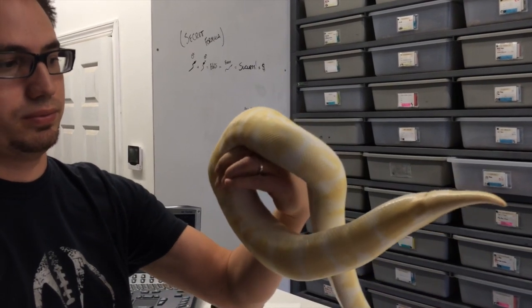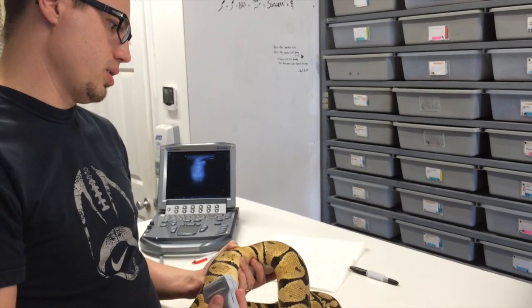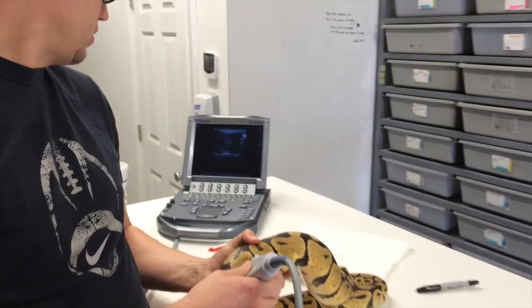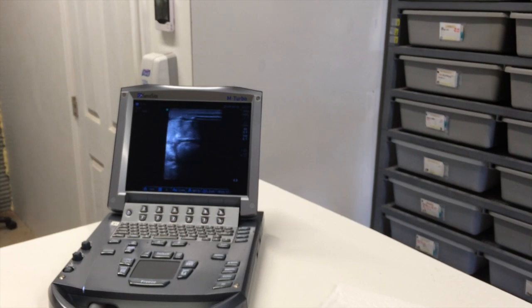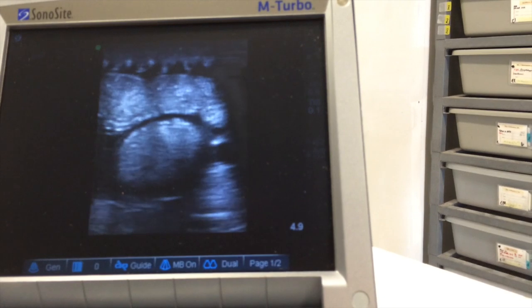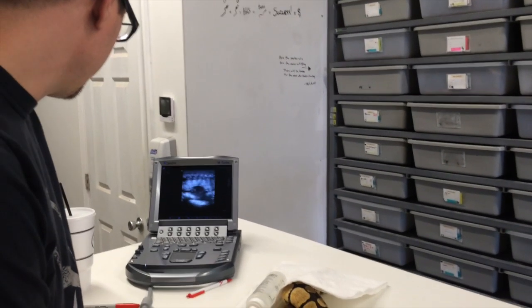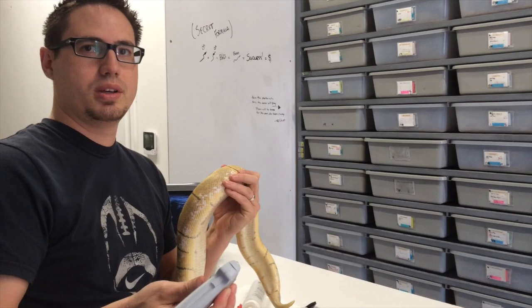Here we have a pastel female. She was at one and a quarter on January 23 and has been bred once since then by a butterfly, so some butterflies here. Looking at the follicles — we have much much bigger growth. That thing's huge. She's moving, but you can see them there — that's a good 2.0, maybe even two and a quarter width-wise. These are definitely great follicles. You can also see the tiny residual ones above — completely normal.